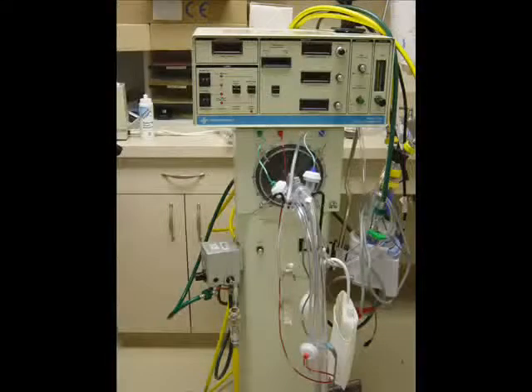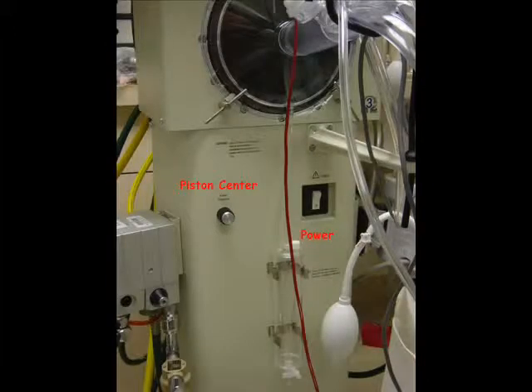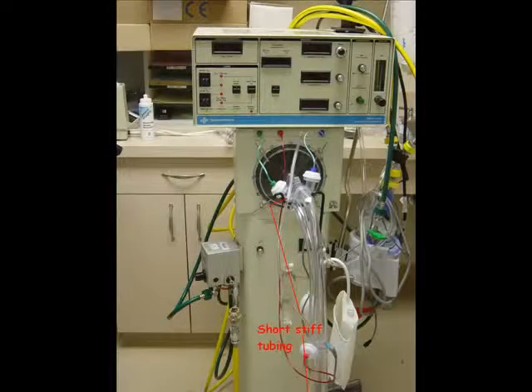Take a look at some of the other functions of the ventilator. On the left you have the air oxygen blender, and on the right the humidifier. Then underneath the control panel you have the control line, the dump line, the air pressure line, and the limit line. Then that's followed by, on the pole is the piston positioning and the on-off. Now the big round black part is the diaphragm that moves, and then here you can see that we're using very short but very stiff tubing so that the maximum pressure is delivered to the child.